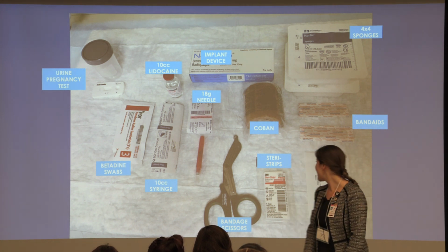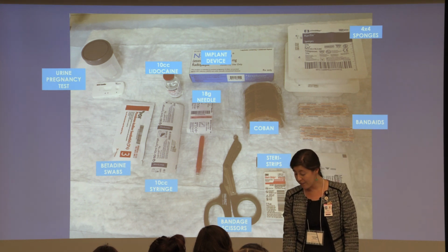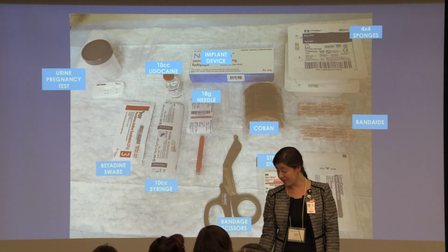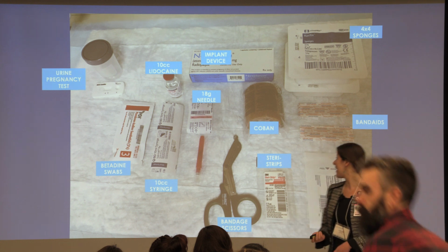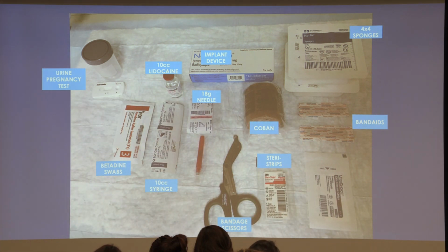And then the device itself, Band-Aids. We use Band-Aids, steri strips, our 4x4 gauze, and Coban. Any questions with insertion? Supplies, tools needed for insertion of the implant.